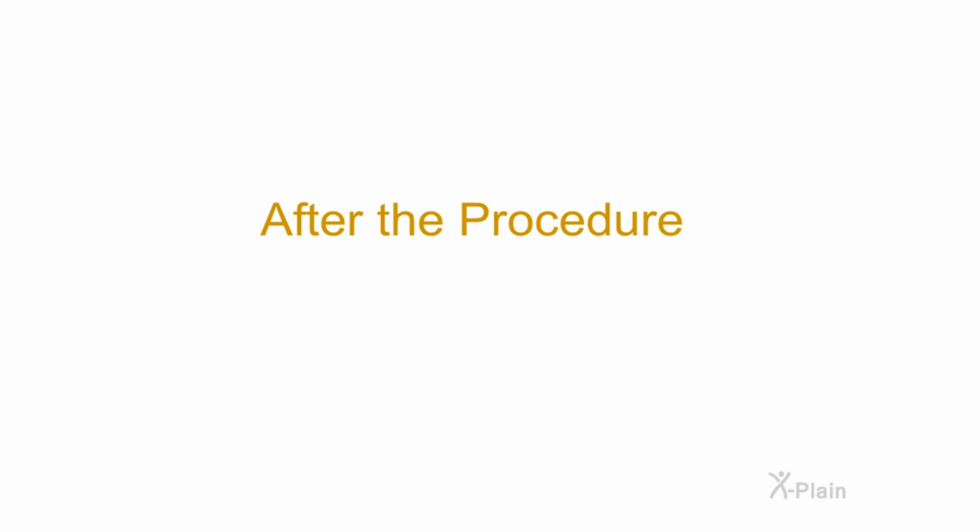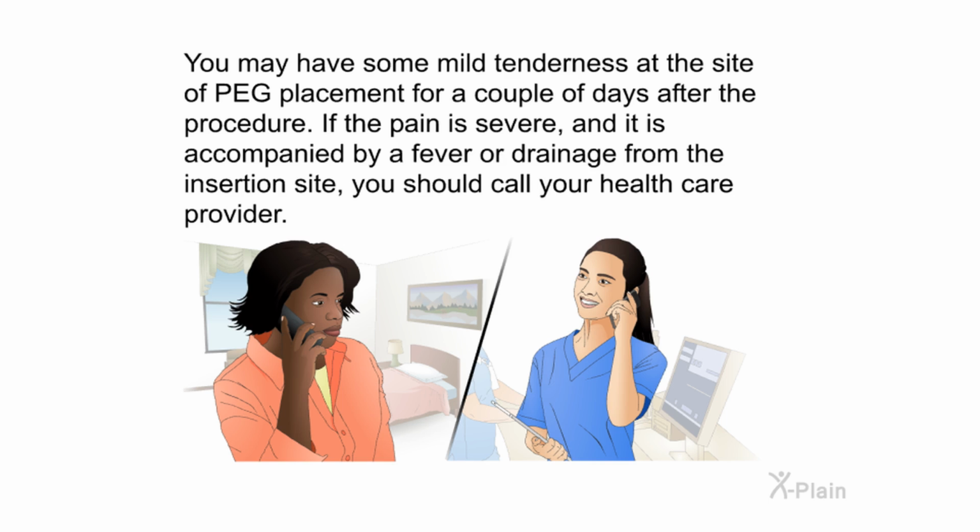After the procedure, you may have some mild tenderness at the site of PEG placement for a couple of days after the procedure. If the pain is severe and it is accompanied by a fever or drainage from the insertion site, you should call your healthcare provider.